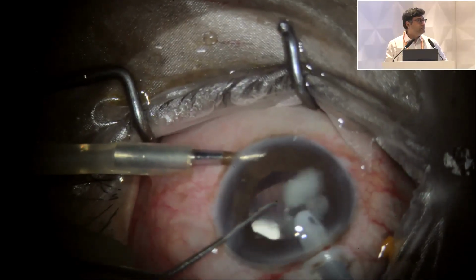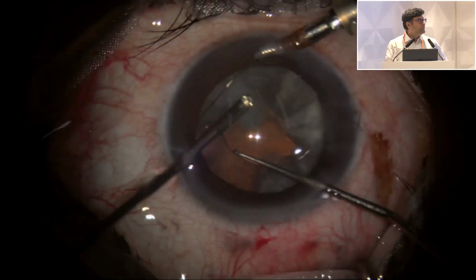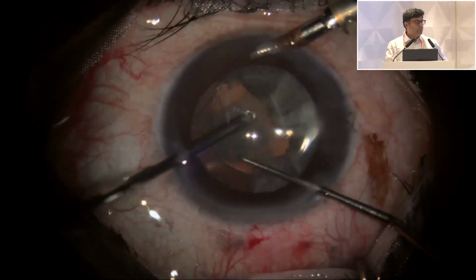You don't really need a fragmentome. This is where you would have used a fragmentome otherwise. Here you use a normal phaco probe, and the other pieces can easily be managed. These are just epinuclear or cortical remnants which would have easily come off with the cutter. So this is one of the ways by which you can manage a nucleus drop if you have an IOL scaffold, by not actually going with a fragmentome into the vitreous.